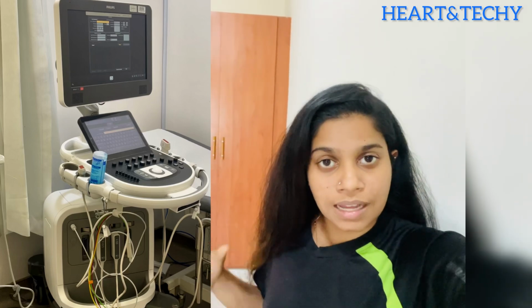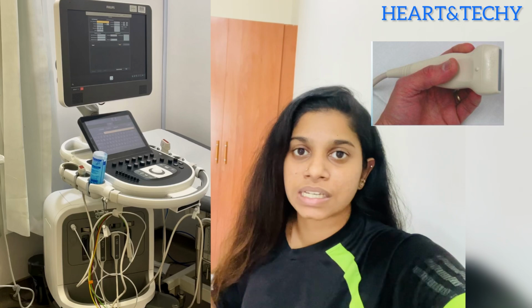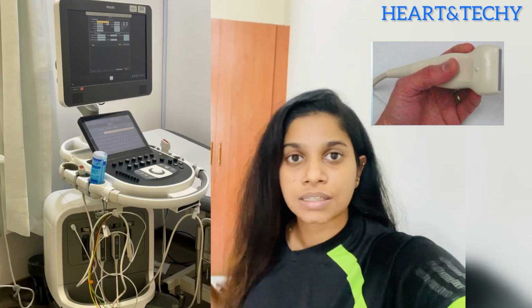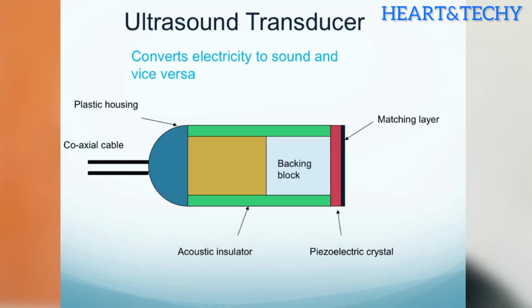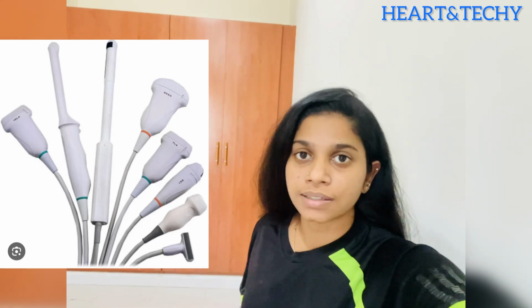In this ultrasound machine, this is a probe. The machine is plugged into the electrical system, so whenever we are giving the electricity, this causes changes in the shape of the crystals in this small probe, and this produces the ultrasound. As I told you, we cannot see the ultrasound. There are different types of probes, as I told you.